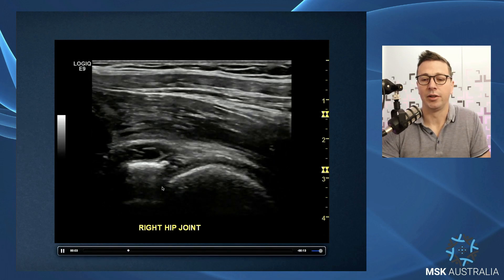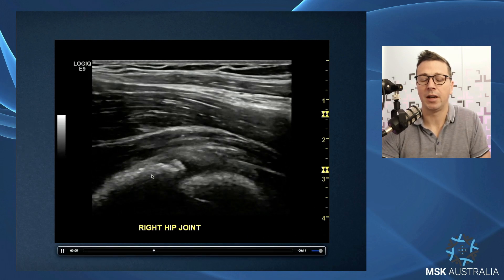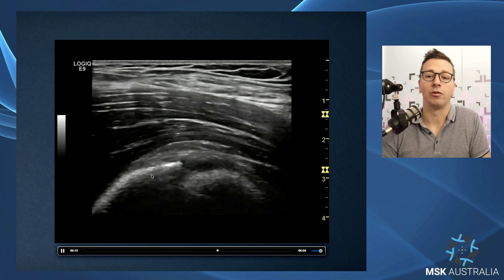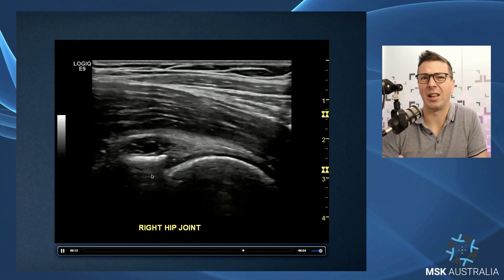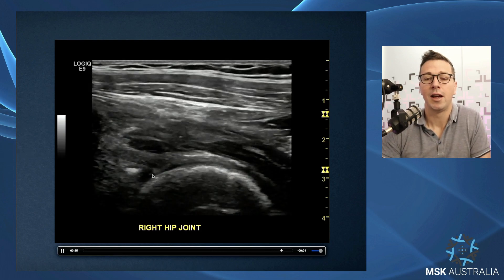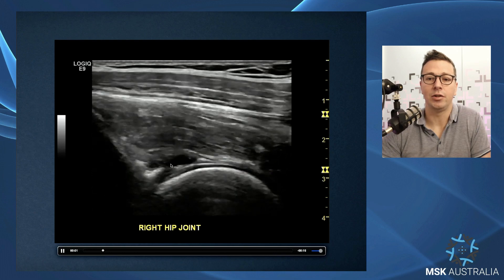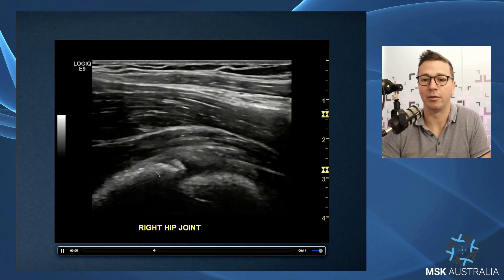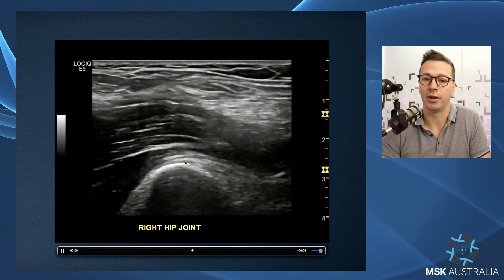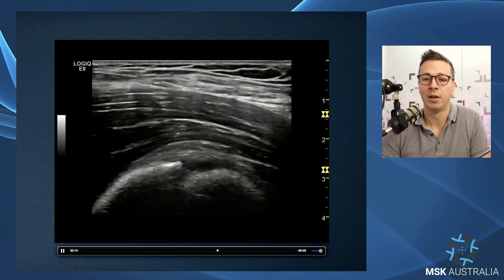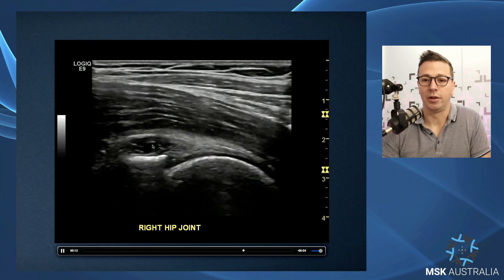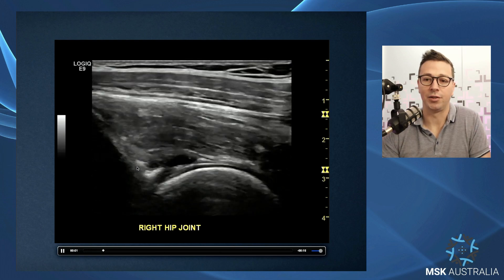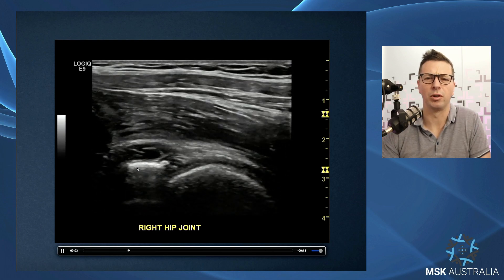These labral tears can become bigger and when larger they're usually associated with degeneration of the joint. Labral tears are the early onset of osteoarthritis, and as that continues you start to see more osteoarthritic changes — bony lipping of the anterior acetabulum. We see not only a complex anterior labral tear but also bony lipping changes on that anterior acetabulum, so we know there's more going on in this joint.